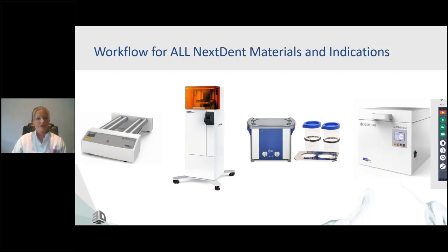And then of course you have your printer, and you'll use your own ultrasonic and a couple of beakers. And this is what your workflow will look like. You just need 91% alcohol to go into this, and it takes 5 minutes to clean your prints. And then you'll have your cure oven. I always say, make sure you get this cure oven, because we've developed the cure oven and the materials for each other. So that oven will heat up, and it's got 2 different color blue lights, so that'll develop the color. And you know everything's fully cured before you put it into the patient's mouth.